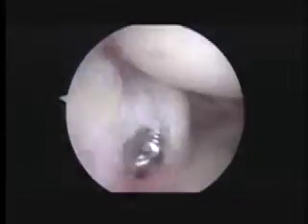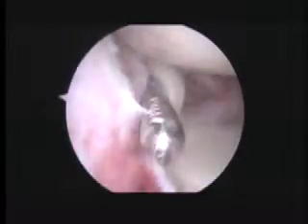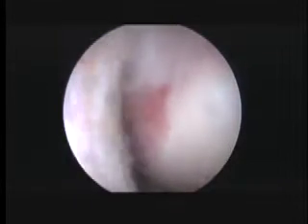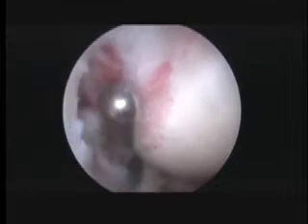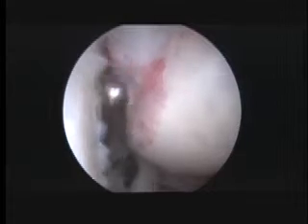This is the torn rotator cuff tendon that we can see from the joint side. And we'll look up here. This is where it's torn. So we're going to be reattaching it right along this part of the shoulder here. We're going to change positions with your arm before we do that. But that pretty well identifies the tear.